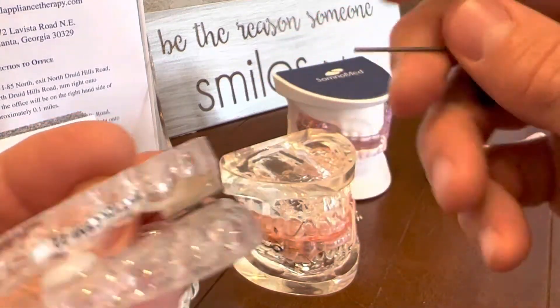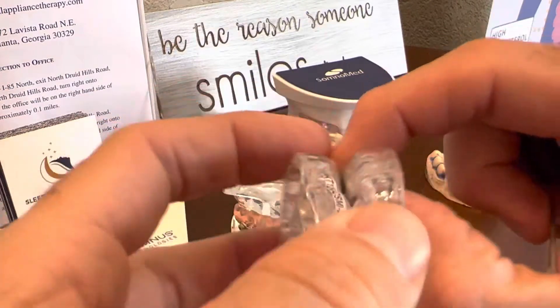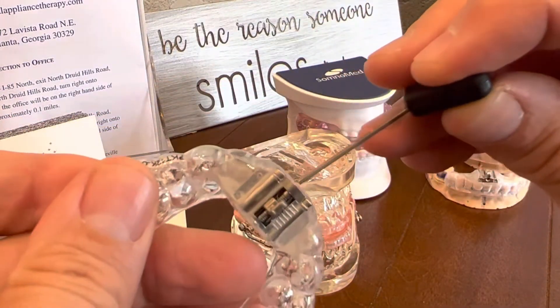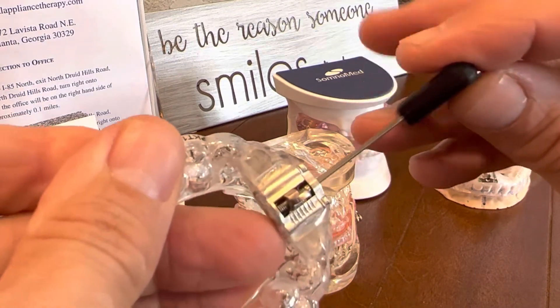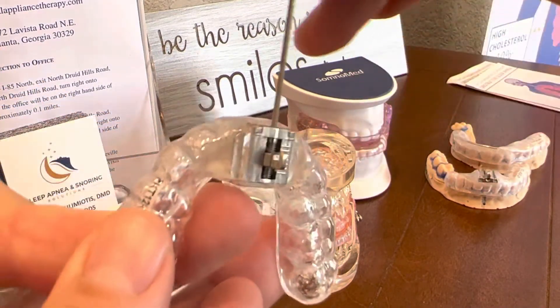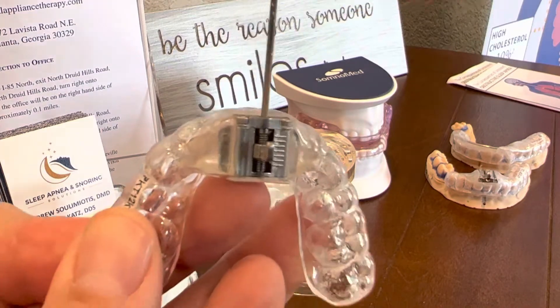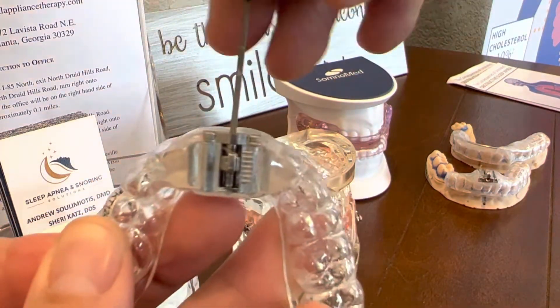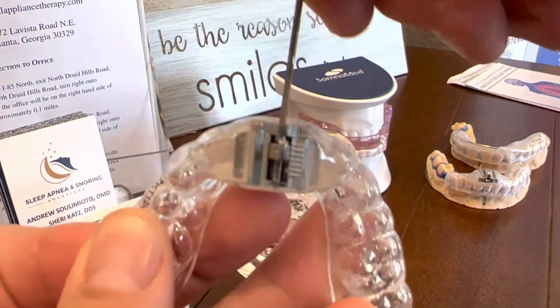Again, remember, you're going to be advancing it by turning it in a clockwise position. So without it in there, this is how it looks — you can see how it spins and moves forward. If I turn it in a clockwise direction, that hook slowly moves forward, just to show you how that works.